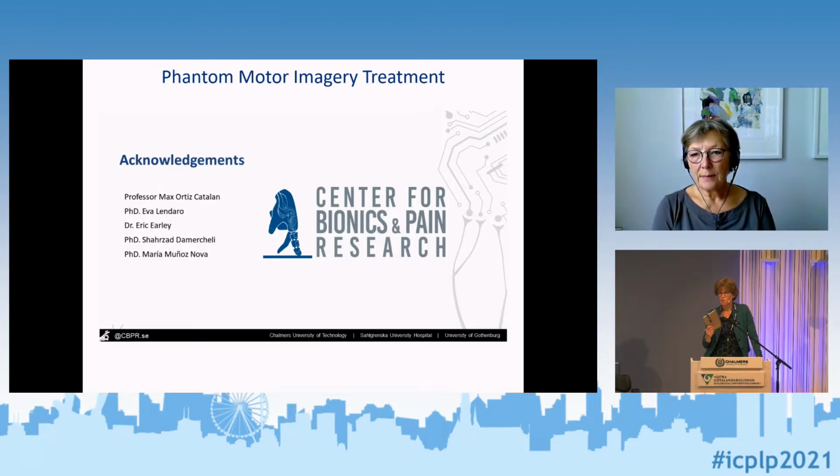This is because of the RCT, where we would have the same situations and same setup for both the execution and imagery part of the research. And the electrodes are actually used to control whether the patient contracts his muscles or not. He should not do that, but this is a nice ability to control whether he moves or not. But if you would like to use this as a treatment, it's not necessary to have these electrodes put on.